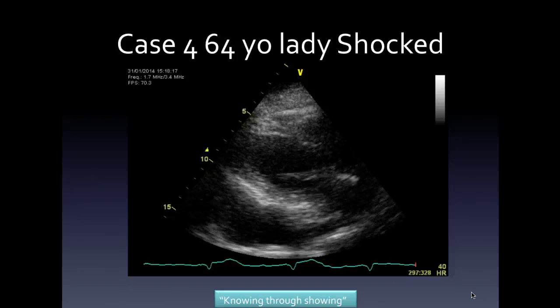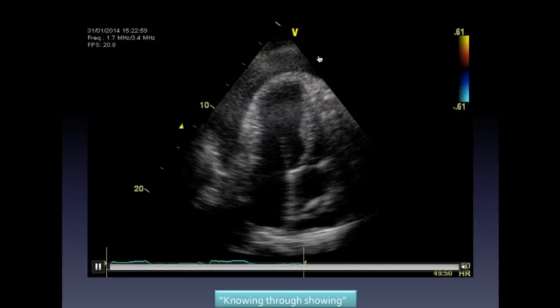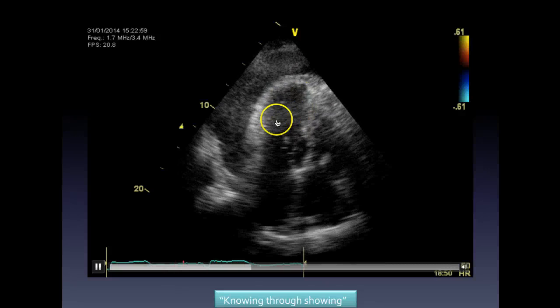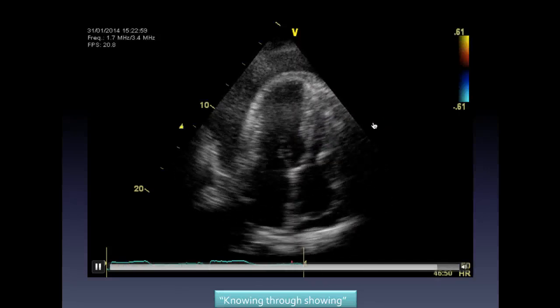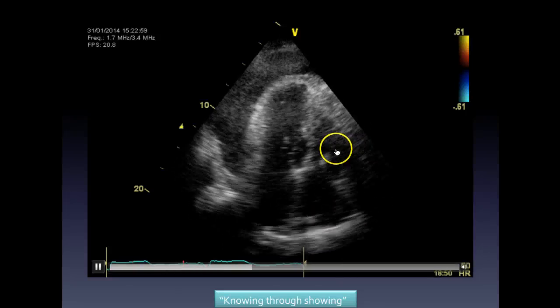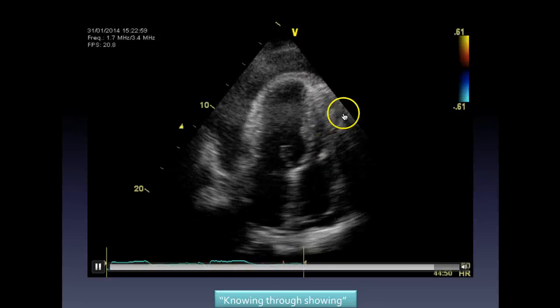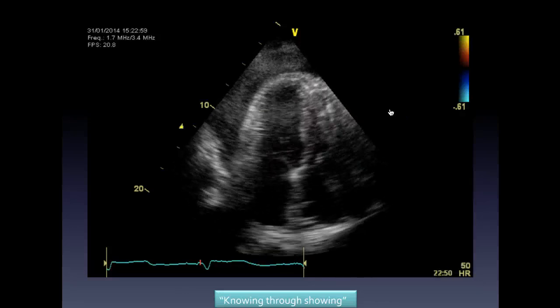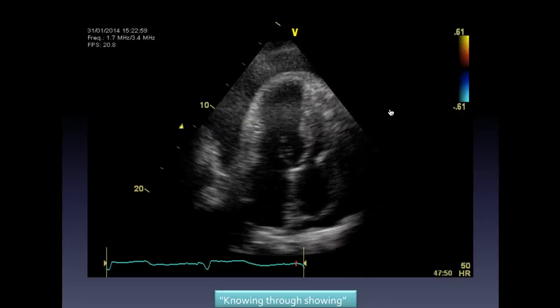Very good. So in the shock, you have a heart that's floating. So again, I know we're talking about ejection fraction, but the big picture here is, is her ventricle entirely normal? Probably not. She's got pacing, you got that dyssynergy, which is harder to see. So that same dyssynergy that you saw earlier isn't as evident if you've got pericardial effusion. All right? So she's got a big pericardial effusion. She's got right atrial collapse, which doesn't always give you hemodynamic compromise, but she's actually got good right ventricular collapse. Okay? So this was a shocked lady, treatment very straightforward, pericardiocentesis, and Ted was on call that weekend, and all was well.